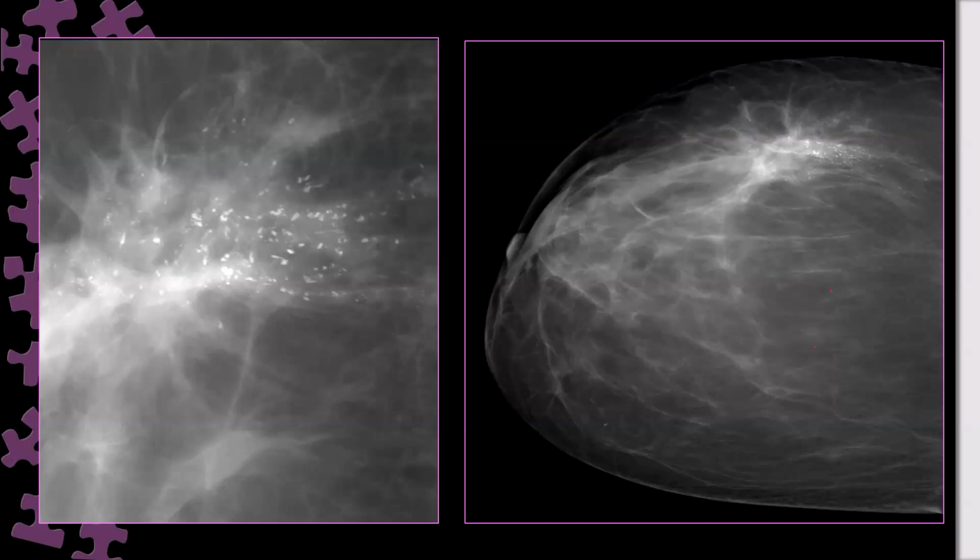But if you have seen something associated with calcification, in this case, you have to start with those things. Then we'll go to calcifications. If it is just calcification, only calcification, then you will go for morphology and distribution.